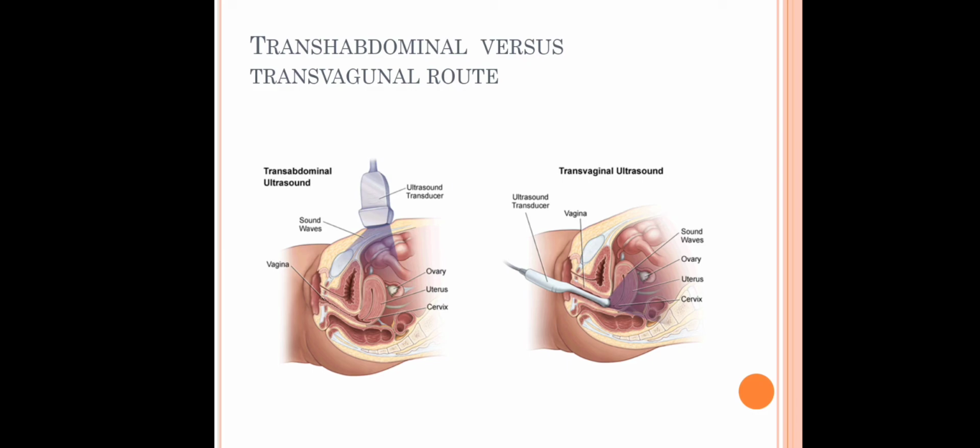Here the wave takes a picture of the uterus. Actually there is bowel and abdominal wall in the abdominal view, while on the transvaginal side we see it is direct on the uterus, and therefore the image resolution is higher than with the transabdominal. The frequency of the abdominal is lower than the transvaginal, and therefore the resolution of the transvaginal is better than the transabdominal.